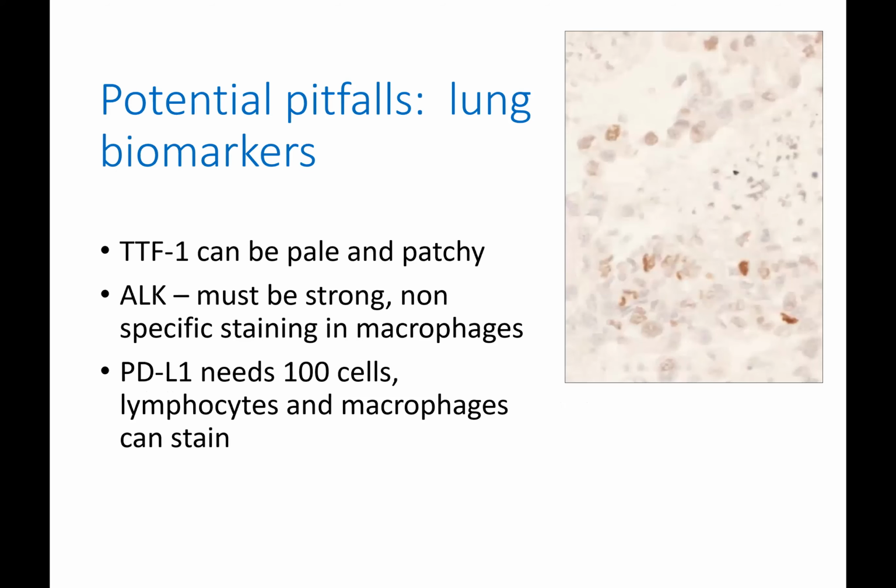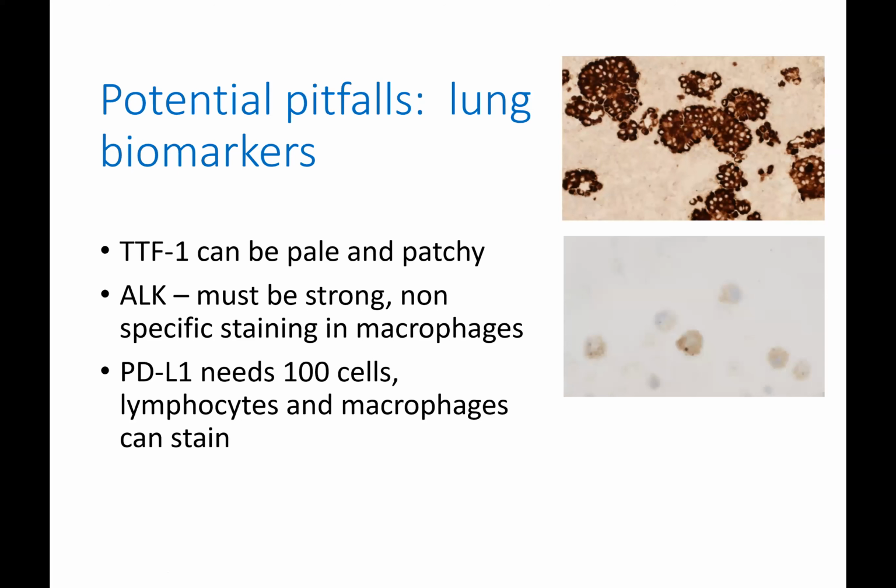At this point, I'd just like to highlight the potential pitfalls with lung biomarker immunocytochemistry. Remember that TTF1, depending on the clone used, can be very pale and subtle and can be extremely patchy, leading to a potential false negative. Lung ALK staining really must be strong to be positive, and remember not to call background staining in macrophages, which is non-specific, as positive.